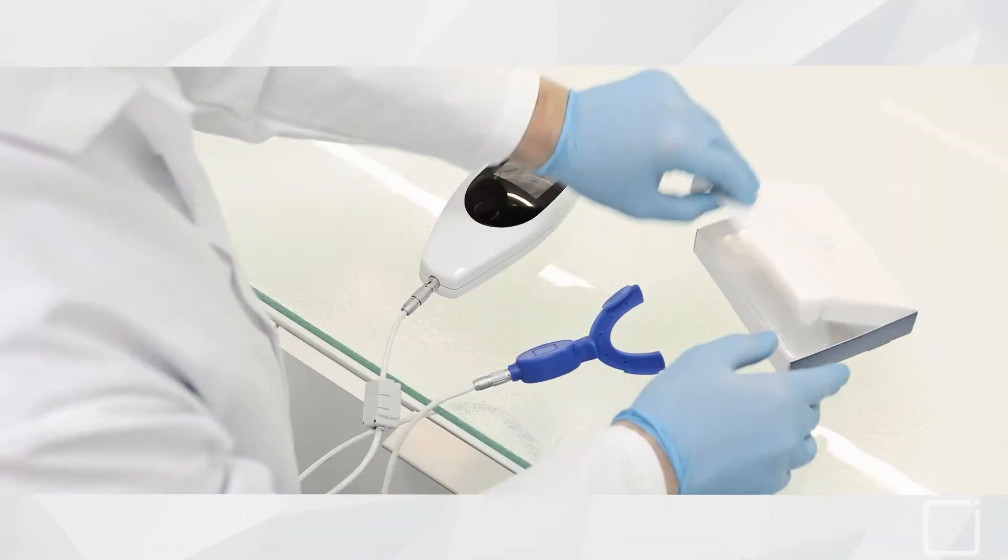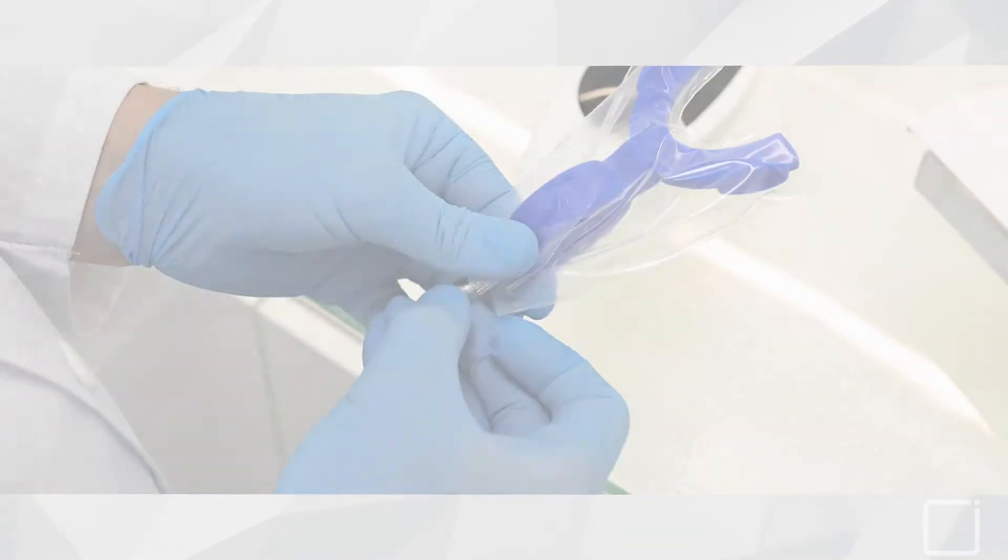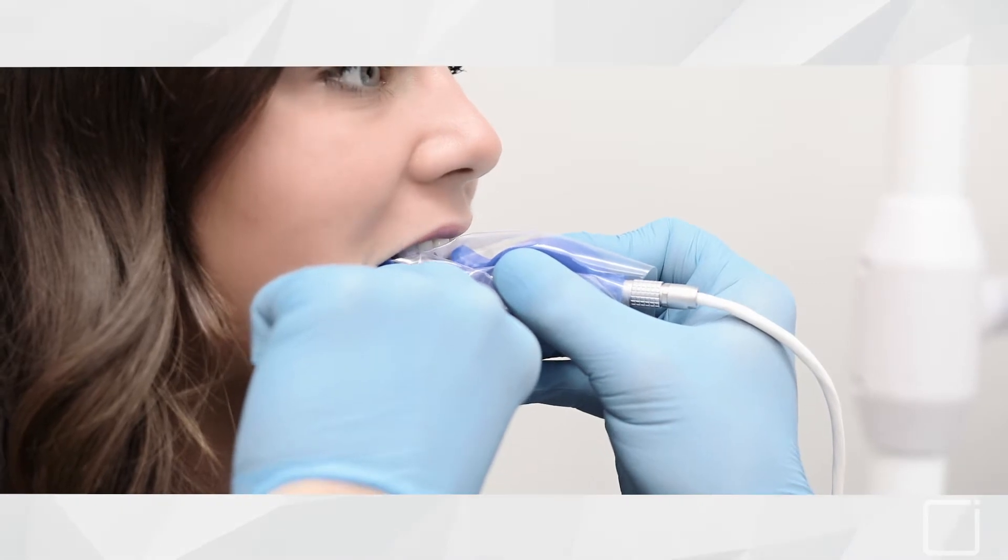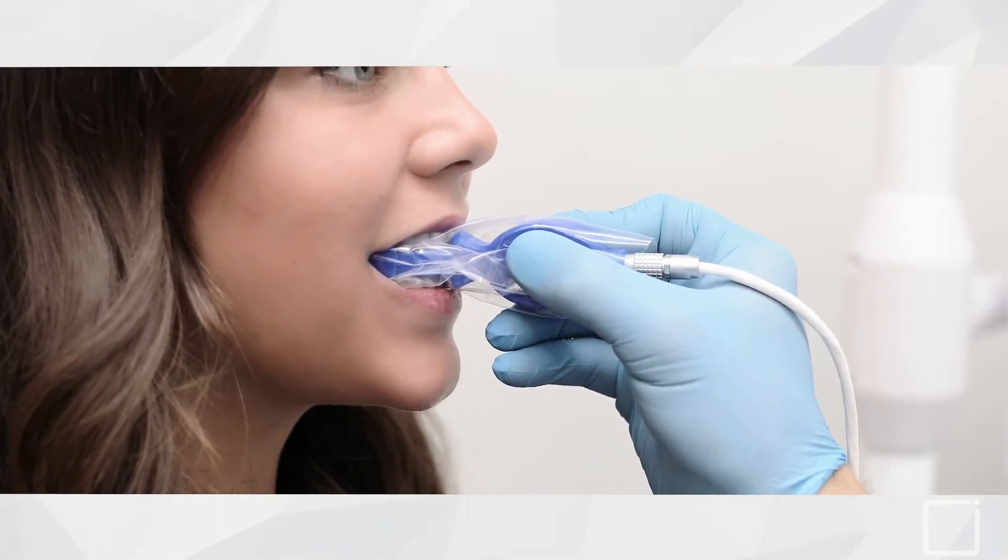You may insert the mouthpiece, which must be covered by a disposable protector, into the patient's mouth. The positioning of the incisors must be placed against the central guide. This will ensure optimal precision of each measurement.